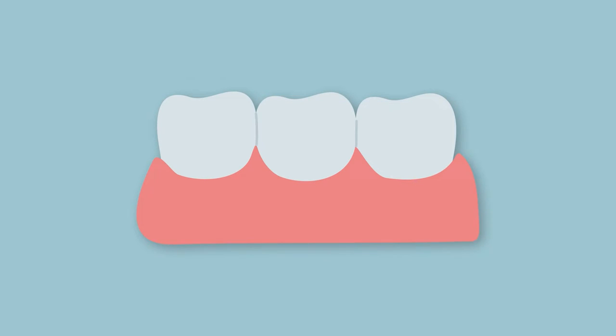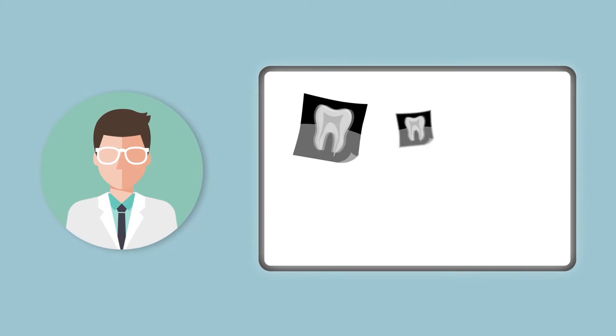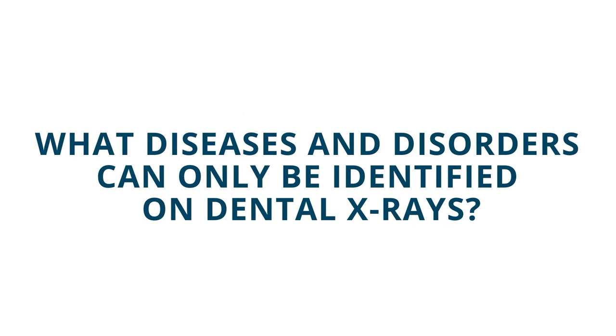Most dental diseases are progressive in nature, meaning they will get worse over time if left untreated. Regular dental x-rays give your dentist the ability to detect problems with your teeth and surrounding jawbones as early as possible. What diseases and disorders can only be identified on dental x-rays?